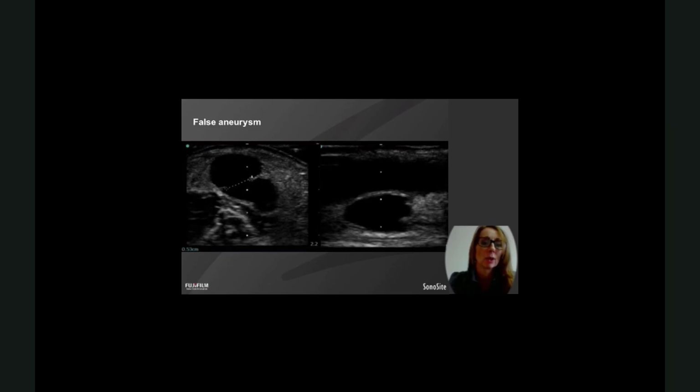They can become quite large, particularly if the fistula has an outflow stenosis and it's under a lot of pressure. Those can become quite large, or they can get infection in them. So they're ones that you really need to keep a close eye on. The benefit of using ultrasound to guide cannulation is that you probably wouldn't have had this happen if you'd used ultrasound to guide the needling, because you would have been able to watch the needle tip and make sure that it didn't pierce back out the side or back out the bottom.